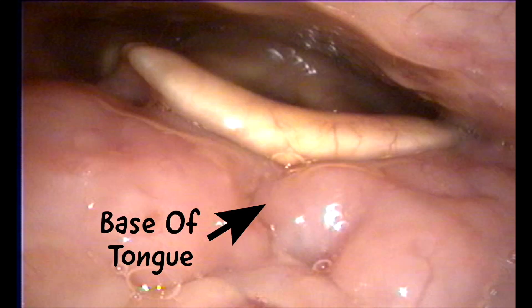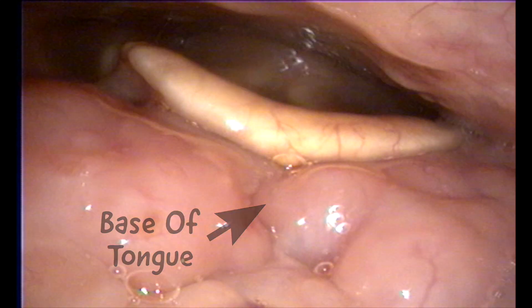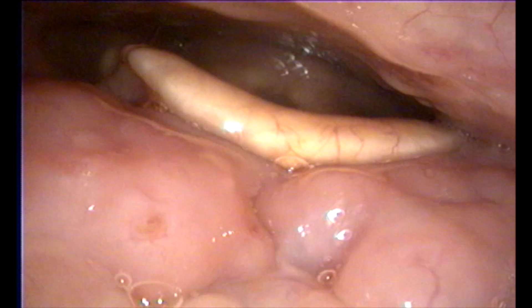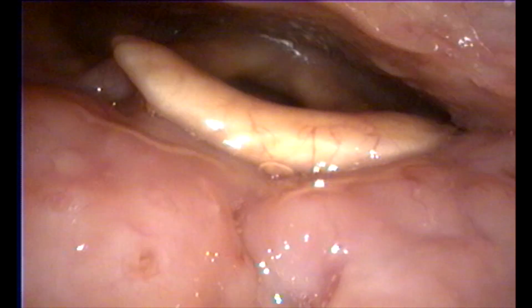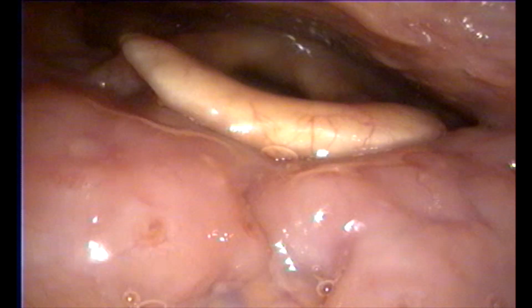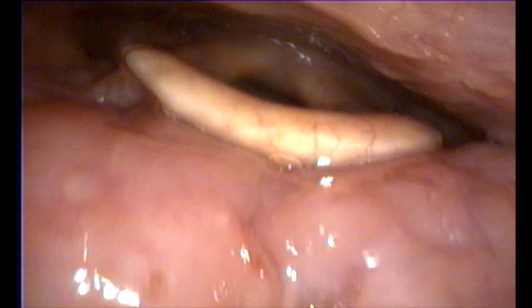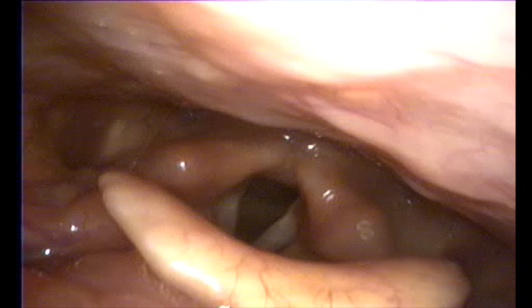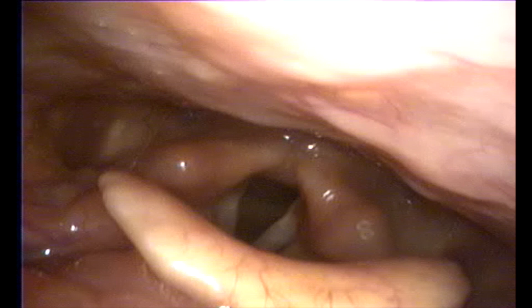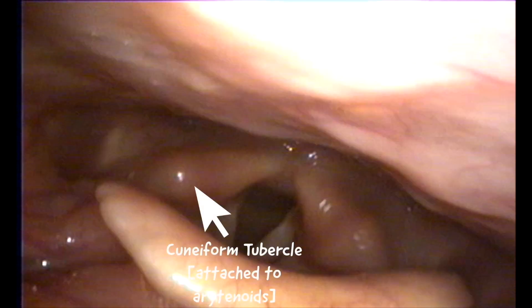Here we can also see the base of the tongue. It is important to remember that the tongue stretches this far back and anatomically is far greater than what we see in the mouth. As the endoscope moves, the image we see should now represent the schematics I have just shown you. Feel free to pause the video here and refer back to those drawings to remind yourselves of the structures involved.